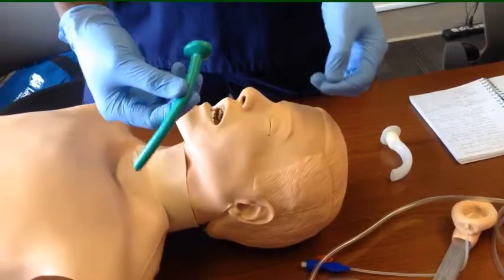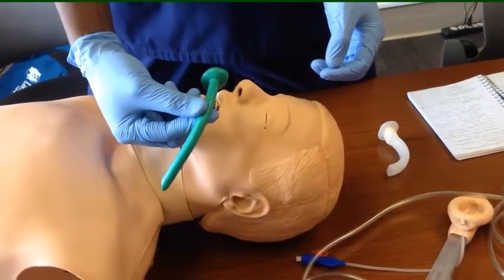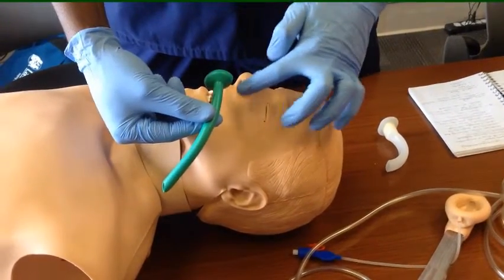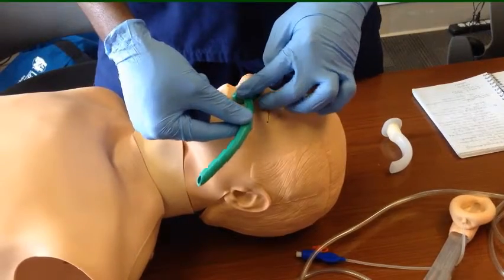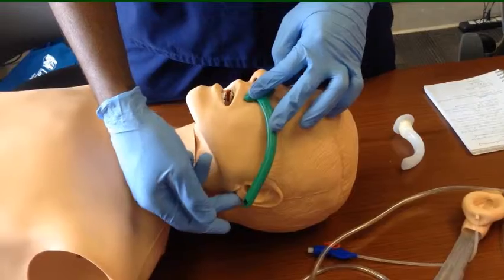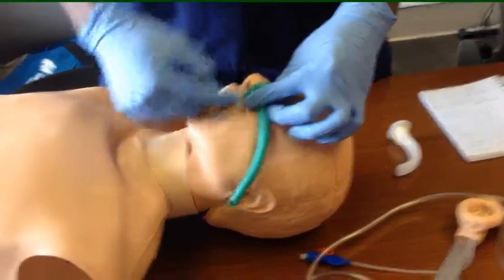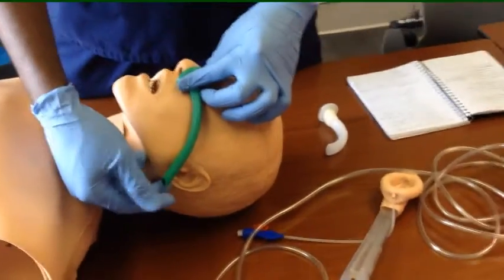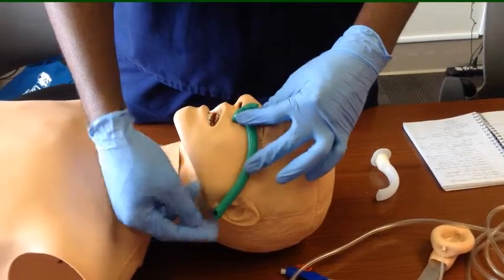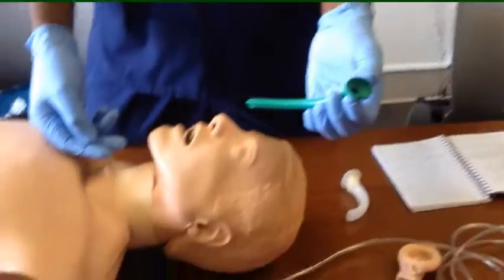And the same thing, this one comes in different sizes. The only way you can know that you have the right size is you have to individualize it to your patient by measuring from the tip of one of the nasal nares to the corner of the earlobe. So you measure from here to the tip of the earlobe. In this case, you can see that it's fitting well for our patient, and that's what we are going to be using for our patient, Mr. Patient.